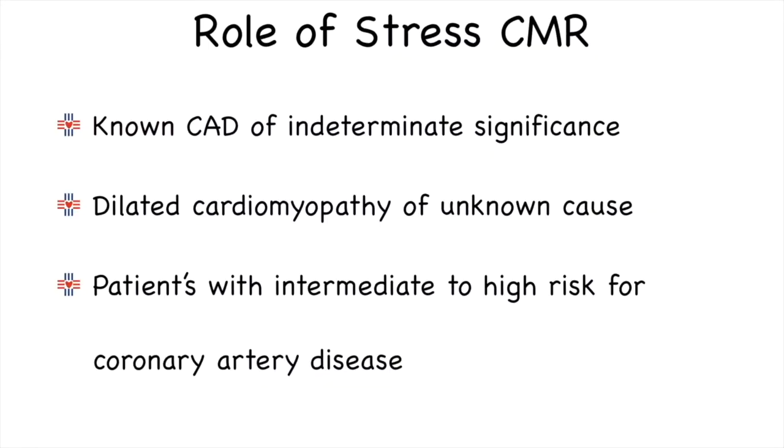Who should be having stress cardiac MR? Well, patients who have known coronary artery disease of indeterminate significance, for example, a patient who's got a 70% or 80% stenosis with atypical symptoms, or patients who present for the first time with dilated cardiomyopathy of unknown cause, whereby coronary artery disease is one possibility. Stress MR is excellent in these patients because it not only will exclude or diagnose coronary artery disease, but it will also look for non-ischemic causes of dilated cardiomyopathy.